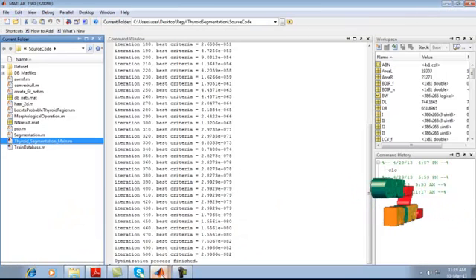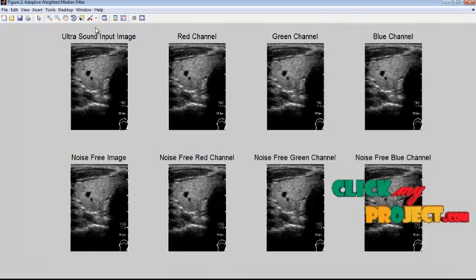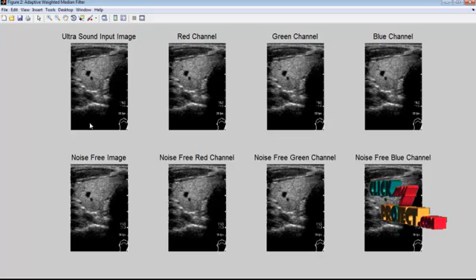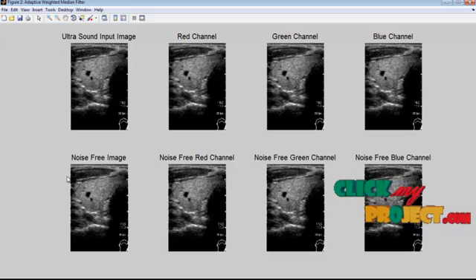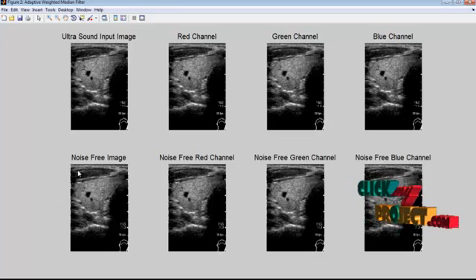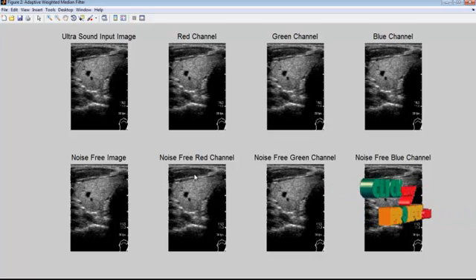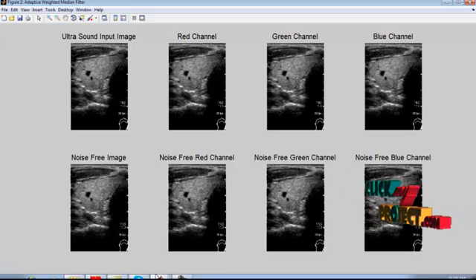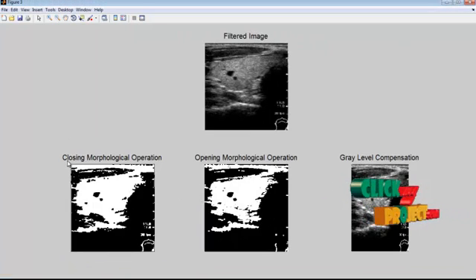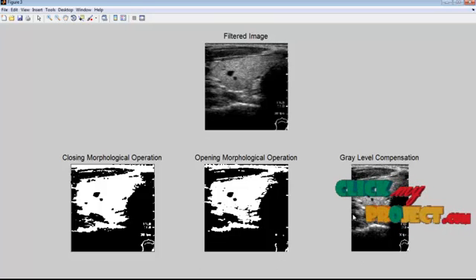These are the intermediate processing steps. We apply the adaptive weighted median filter to the red, green, and blue channels of the ultrasound image. This is the noise-free image obtained after filtering, along with its corresponding noise-free RGB channels. This is the output of morphological operations — closing and opening — and the gray level compensation output.